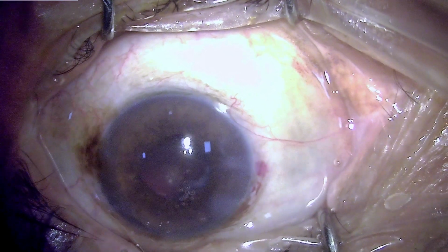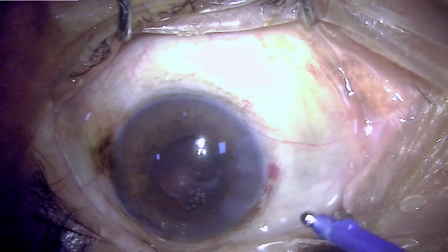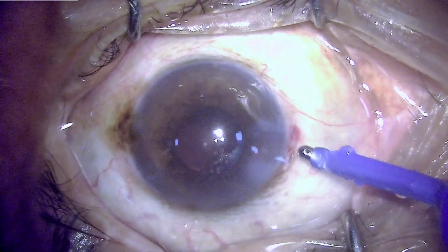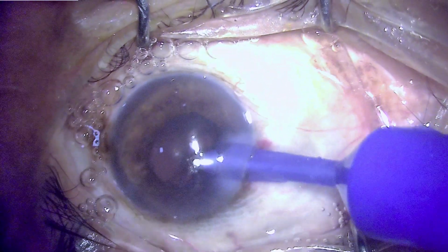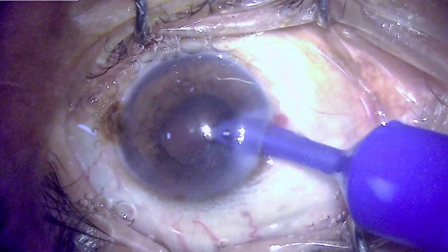Now here we can see that there is an epinucleus along with a sheet of cortex which has been left behind, and this will again require a lot of effort, and this is usually the situation where the posterior capsule integrity is compromised.